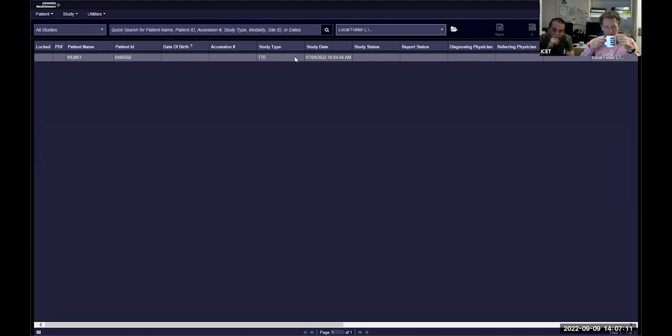Given the hyperkinetic function basally, I'm worried there's going to be some left ventricular outflow tract obstruction. From what you've told me, I'm thinking it's just going to be a takotsubo to start with. It could be an ST elevation myocardial infarction. It doesn't quite look like a myocarditis, but that's another possibility given the troponins.